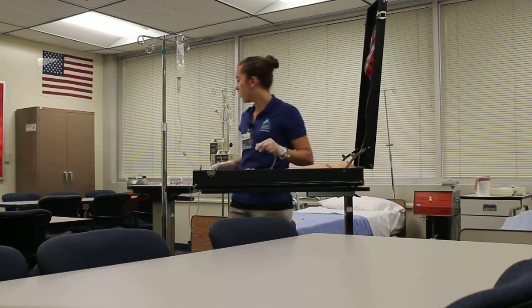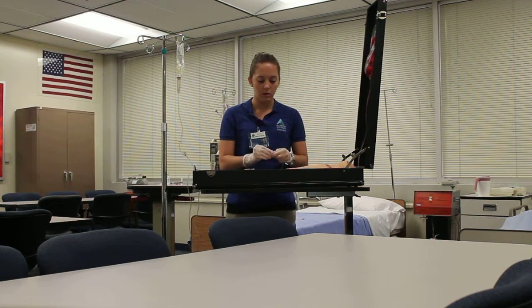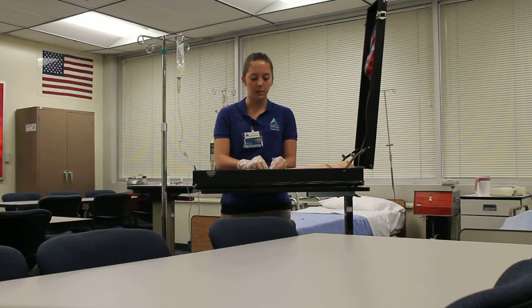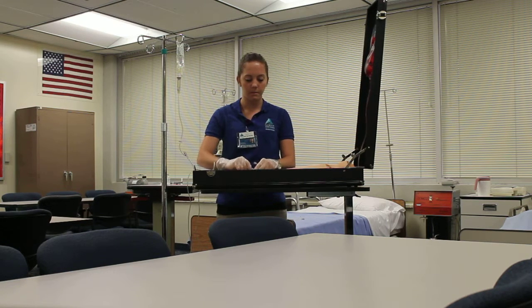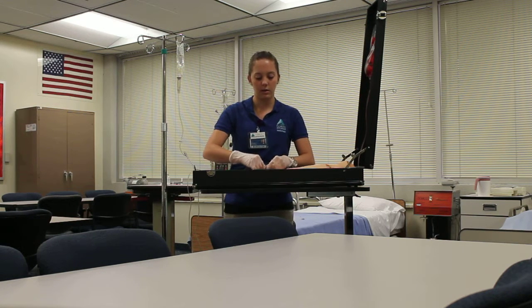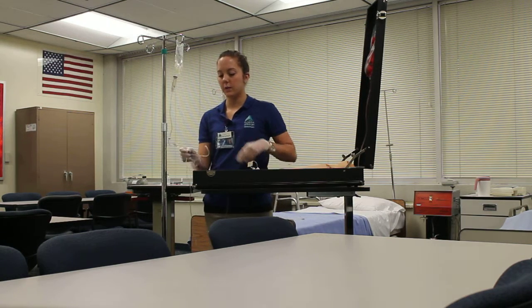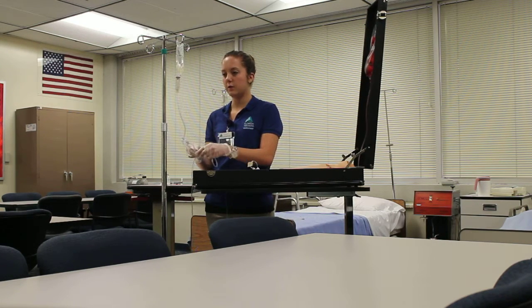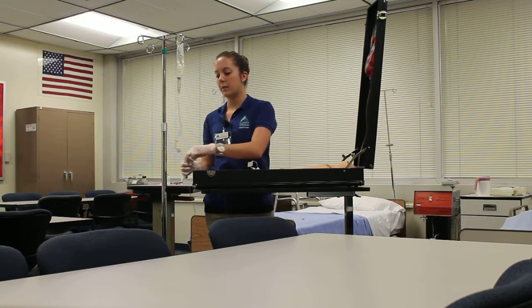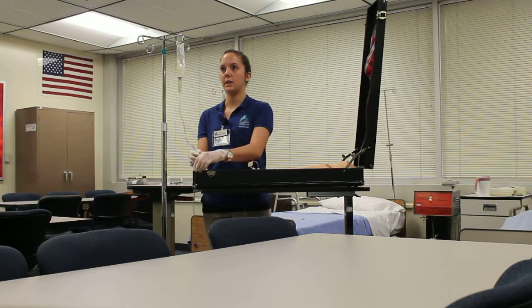I'm going to use my alcohol prep to wipe off both tubings again. I'm going to make sure my IV tube is clamped. I'm going to go ahead and connect the IV. At this point I can go ahead and unclamp my IV tubing. I want to count my drops per minute using my watch, which I've previously calculated to be 17.